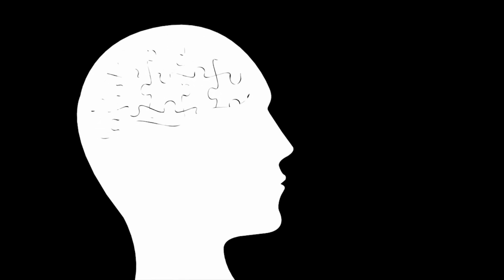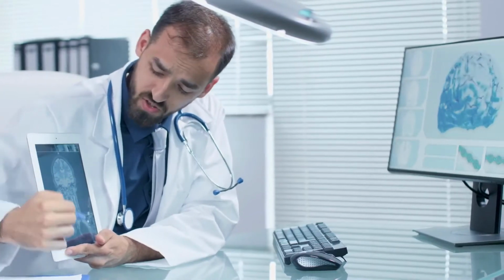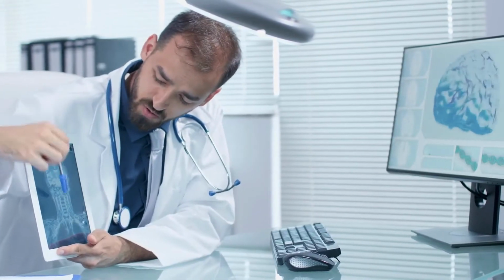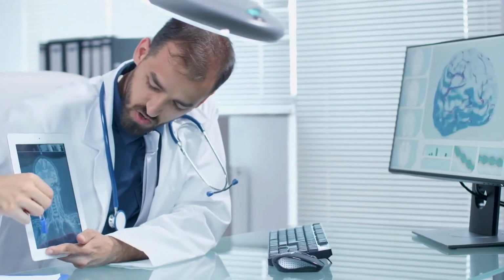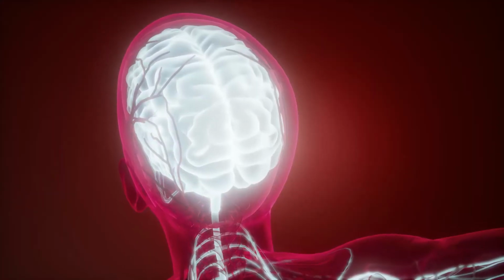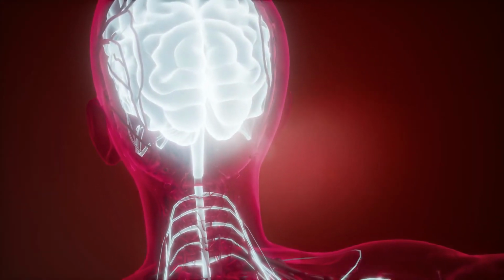This file can then be used by medical staff members, and the file can be attached to a patient's medical notes for future reference. It can be printed to paper or slide material, so can be used the same as any standard X-ray, but without as much risk and usually at lower overall cost. The initial expenses with a digital system can be immense, but over time they usually pay for themselves.